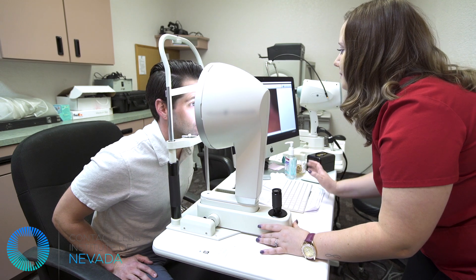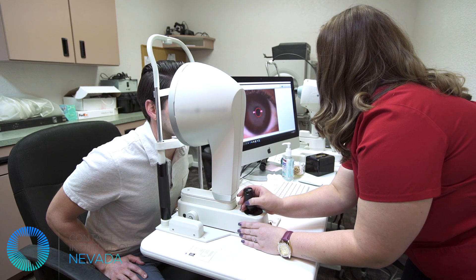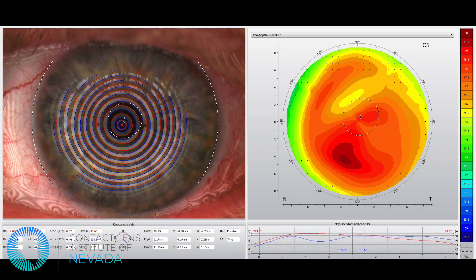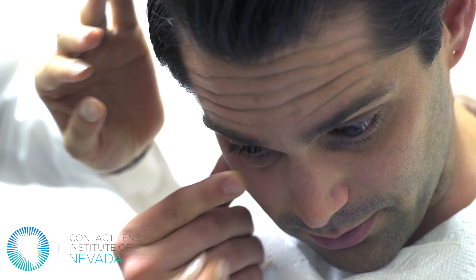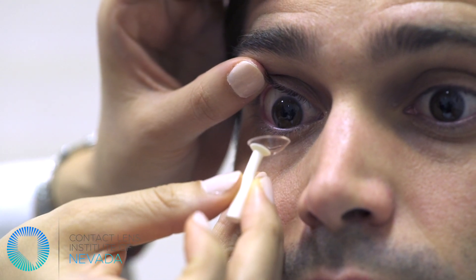During your scleral lens fitting, your practitioner may be trying on different scleral lenses to ensure a proper fit. If your practitioner uses special technology to assist with this fitting, you may not need as many trial lenses. The amount of lenses varies between each patient — sometimes only one or two lenses, and other times ten or more. Each patient and eye is different.